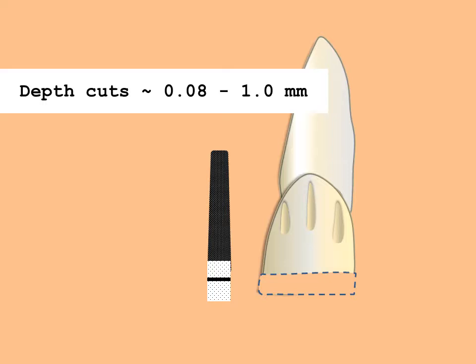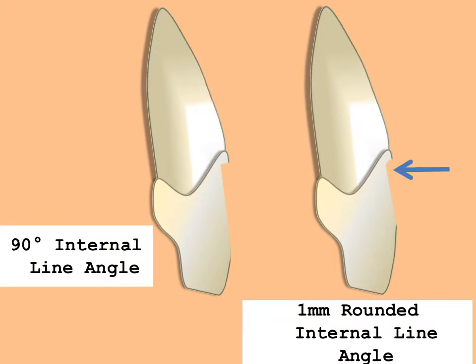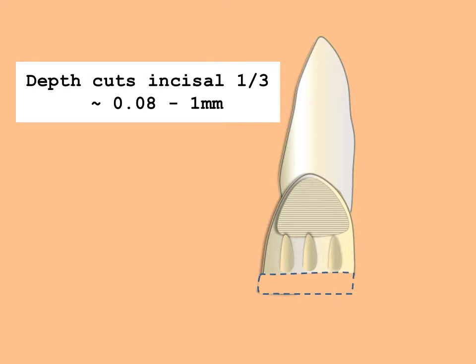Reduction is assessed and then completed. Reduce the labial as far into the embrasure as possible without abrading the adjacent tooth. A 90-degree shoulder may be used for the ceramo-metal crown if the porcelain butt margin is to be used. After completing reduction of the cervical two-thirds of the labial surface, the incisal one-third is reduced. The burr is oriented parallel to the facial surface, and again three depth grooves are placed. The entire labial surface of the tooth is reduced one millimeter, carrying the reduction into the embrasure as far as possible without abrading the adjacent tooth.